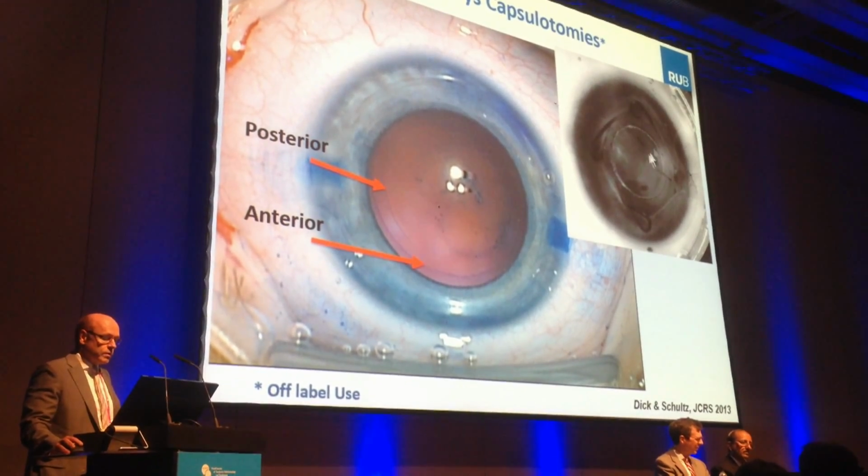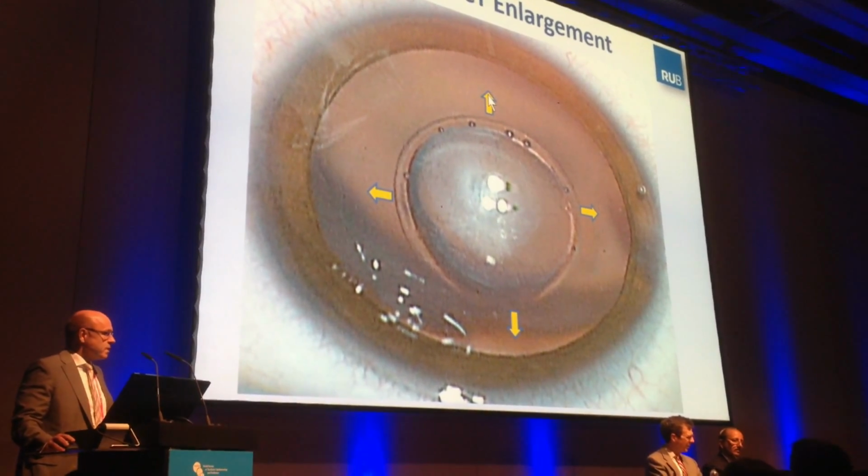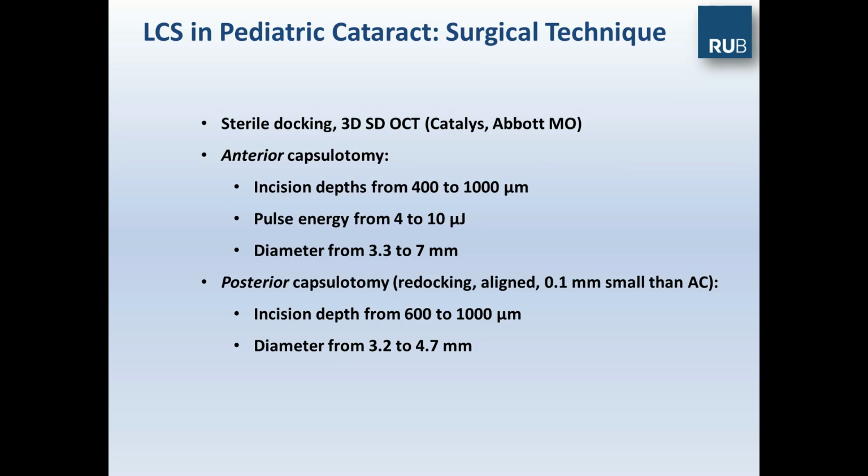This is a docking view. And you see that there was some capsulotomy enlargement. So it was greater than intended.